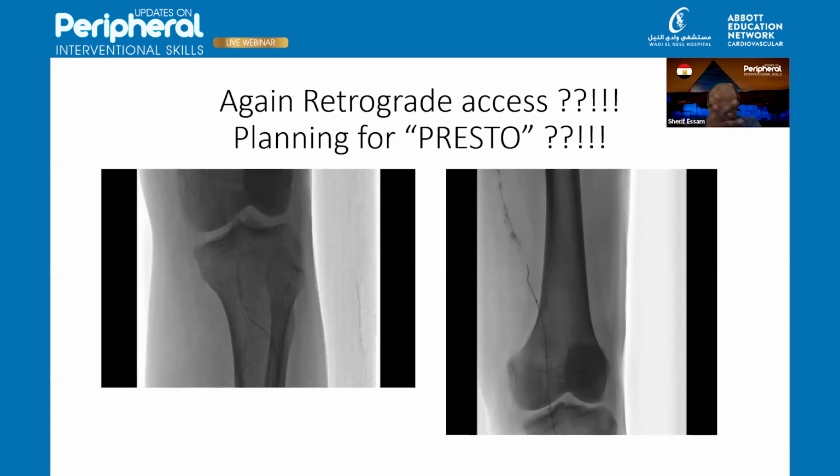Because the Supera stent has compression resistance and flexibility, which for most stent manufacturers is a design trade-off. Most stents have to sacrifice one of these characteristics for the sake of the other. If you want a stronger stent, it will be less flexible, and vice versa. But in this particular lesion, because it is heavily calcified, you need a high compression resistance stent, which is the Supera.